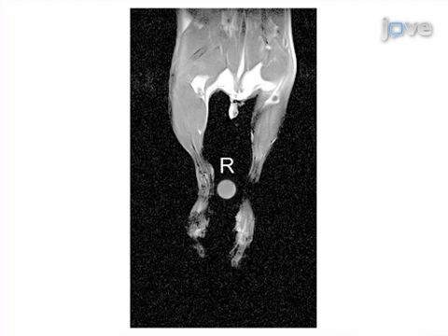The final step is to process the image data to calculate the number of cells. Ex vivo histology or other techniques can be used to corroborate the data where possible.